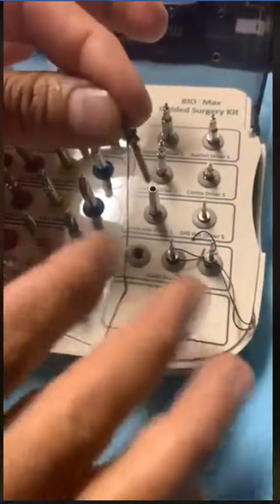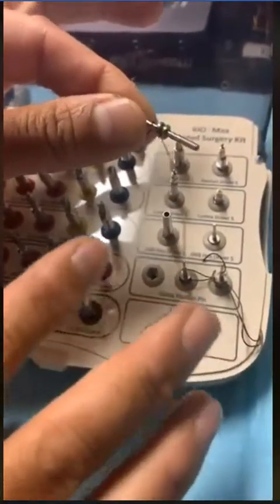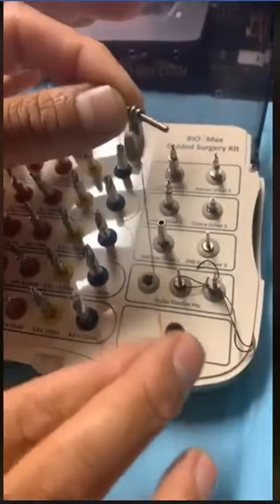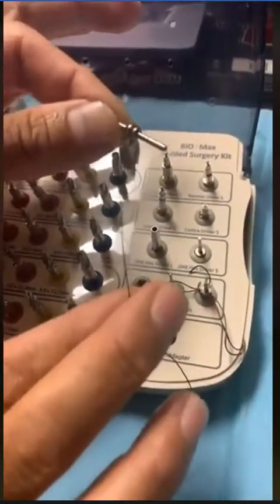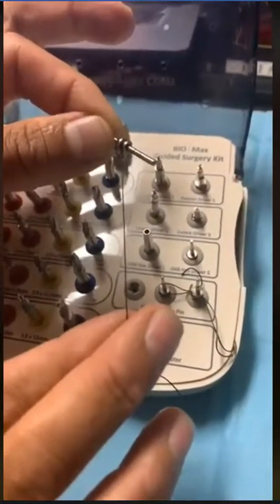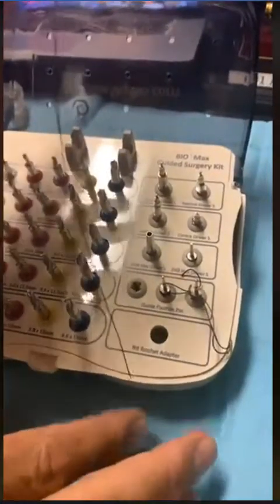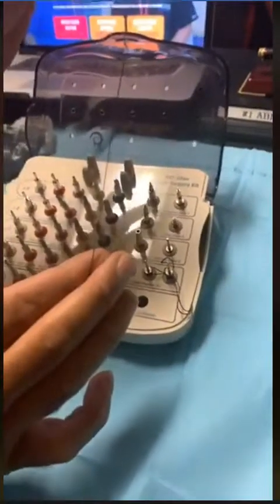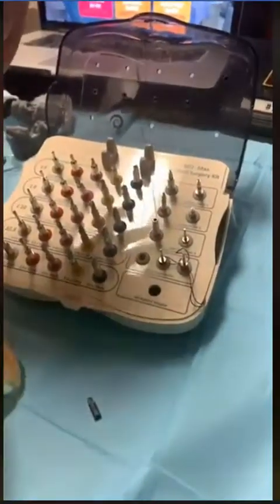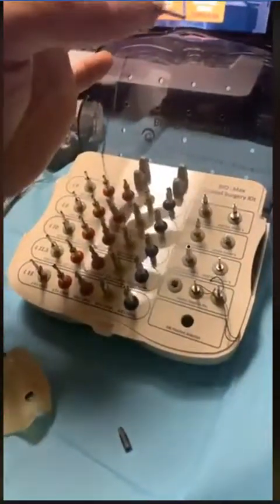Now these connections, I have my assistant Pierre, who's videoing right now for us, put these floss, or you could use a silk suture that I buy as a loose silk suture, and you could autoclave it, and every once in a while you have to switch it. Now the reason I put this in, can you guess why this is? And look how long I put it, okay? The reason I do this is these little things can drop in the patient's mouth very easily. Especially if the patient is sedated, you could grab this thing and take it out. That's why we have these connections on them.